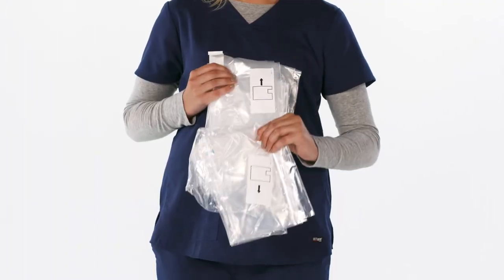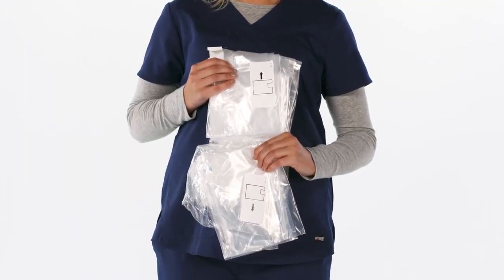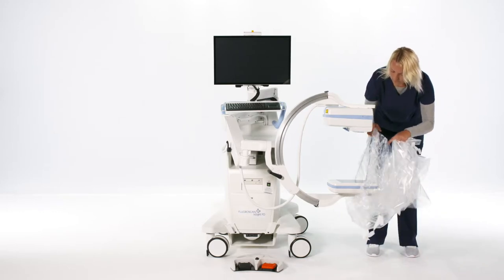For operating room use, small labels on the drape indicate how to fit the drape to the X-ray head and to the detector.